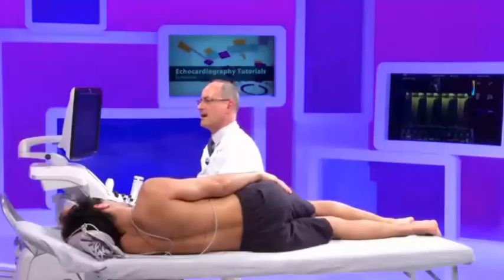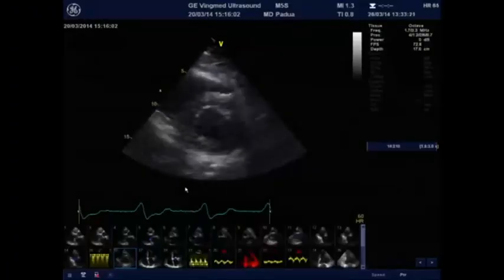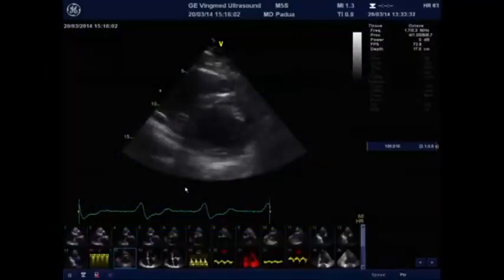Usually it's a little bit higher immediately after the transplant, when the body and the heart are adapting to the previous dysfunctioning heart. Usually it declines during the first months after transplant and then stabilizes unless there is any complication, and usually the complication is the dysfunction of the left heart. Then I go back to my short axis view at the level of the left ventricle to have an overview of the global ventricular function. And you see here it's quite a good left ventricle in this patient.